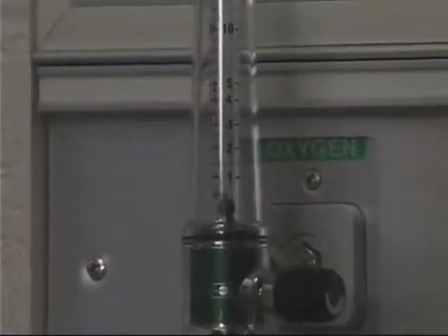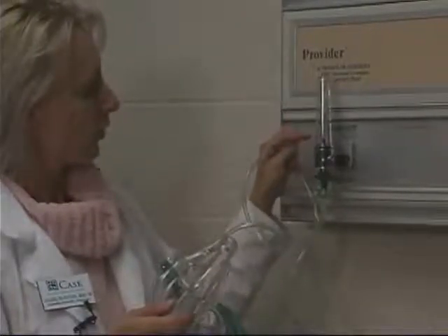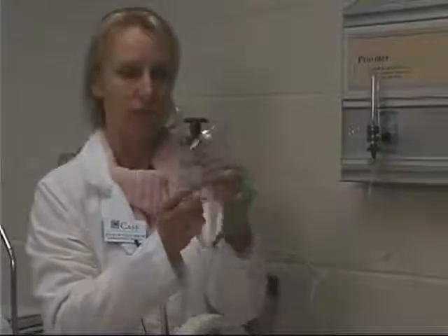For the simple face mask, this flow meter is going to be set anywhere between 8 and 12 liters per minute. This flow meter ranges from 1 liter a minute up to 15 liters a minute, and you're going to need to set this between 8 and 12 — that's pretty high. The reason you need a high flow of oxygen through the simple face mask is that as the patient exhales, the exhaled air is going to be partly contained inside this face mask. Not all of it goes out through the ports. That exhaled air contains a high amount of carbon dioxide, so you need a high flow of oxygen to help push the carbon dioxide out through these ports so the patient isn't re-breathing it.